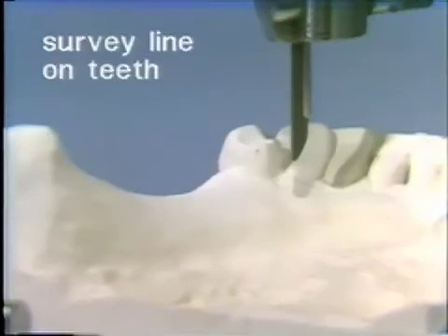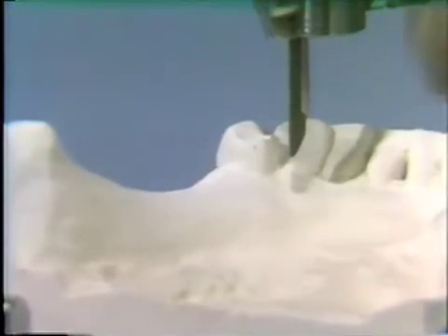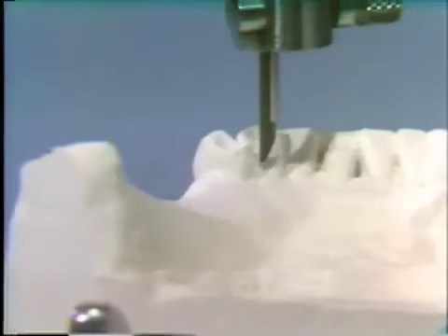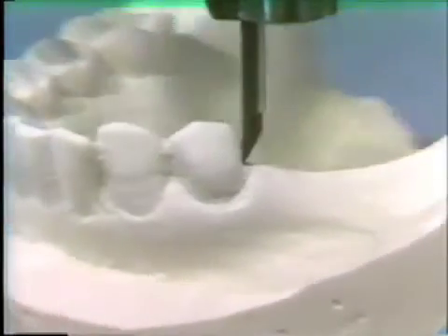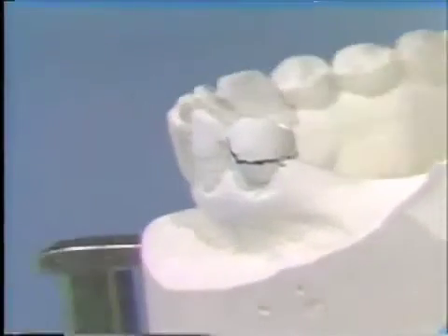Once we have the path of insertion and removal determined and selected, another use of the surveyor would be to draw the survey line on the abutment teeth. For this, we have the carbon rod protected by the shield in the tool holder of the surveyor. With the cast locked on the cast holder, holding the carbon rod against the stone tooth, we rotate the cast around the carbon rod and draw the survey line or height of contour line around that abutment tooth as well as any other abutment tooth involved in the cast.